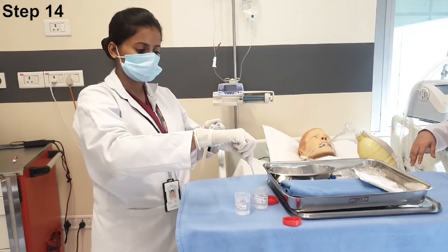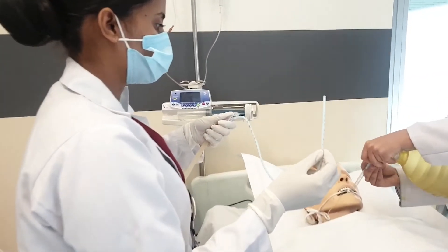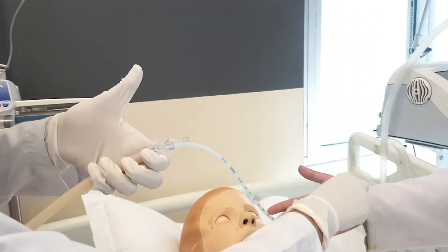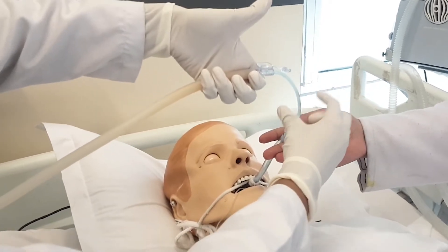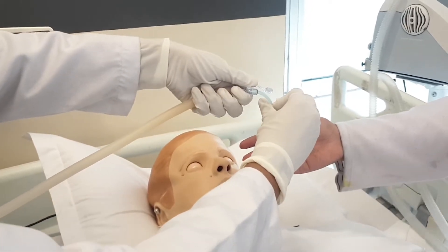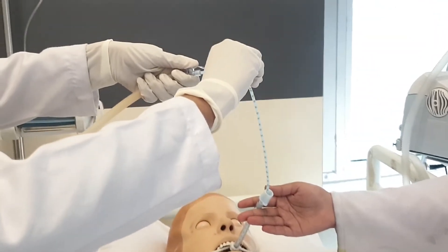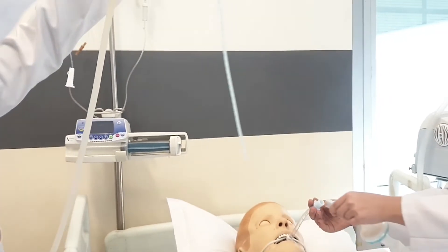The assigned nurse will pre-flush the suction catheter with normal saline without applying suction pressure — that is, do not press the thumb on the suction catheter. Insert the suction catheter until resistance is felt, then pull back 1–2 cm. Apply suction pressure by pressing the thumb on the suction catheter and remove the suction catheter in a rotatory manner within 8–10 seconds.